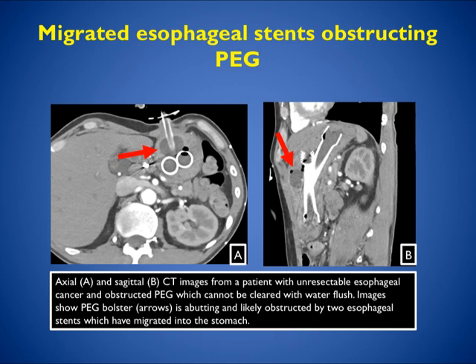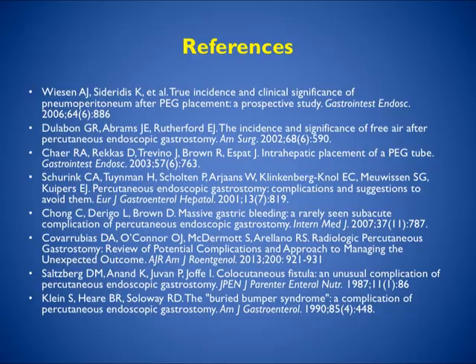Here's an example of migrated esophageal stents obstructing the PEG. The patient had no luck — the PEG bolsters are abutted and obstructed by the esophageal stents, which have migrated into the stomach. You want to look very carefully when stents are in place and look for complications between various devices. PEG tubes are something we're seeing more of, used particularly in older and frail populations, and it's our job to detect complications — particularly when they're unsuspected. Hopefully this talk will help you do that better. See you tomorrow.